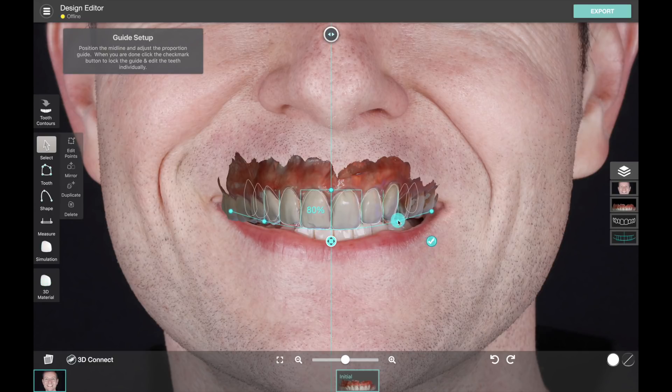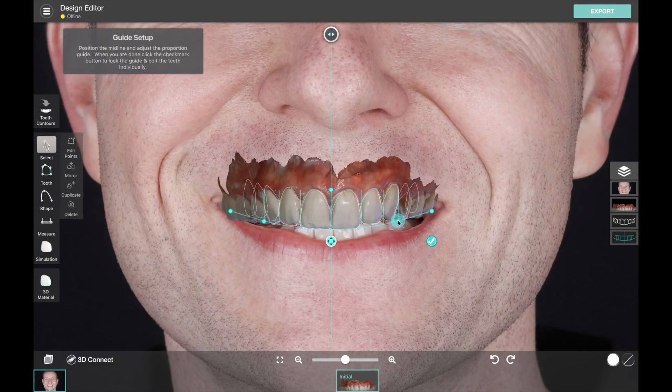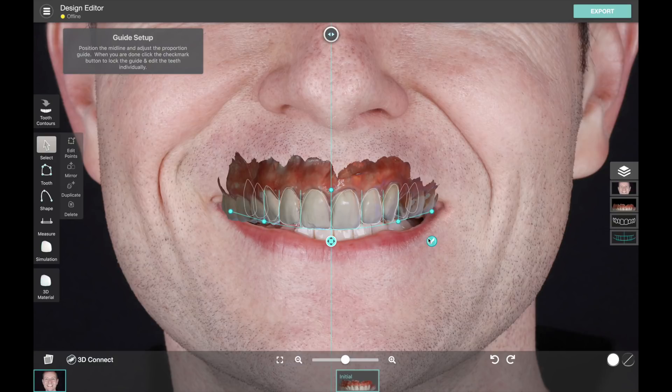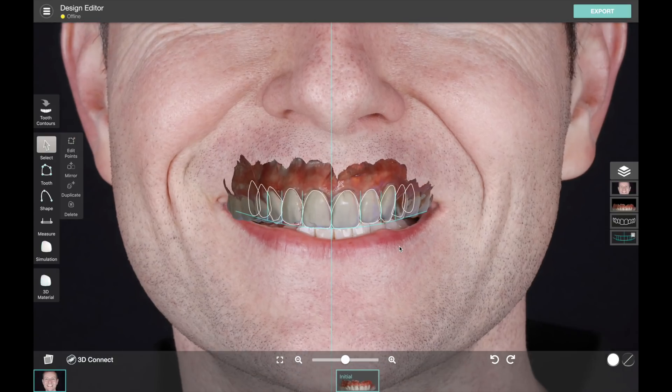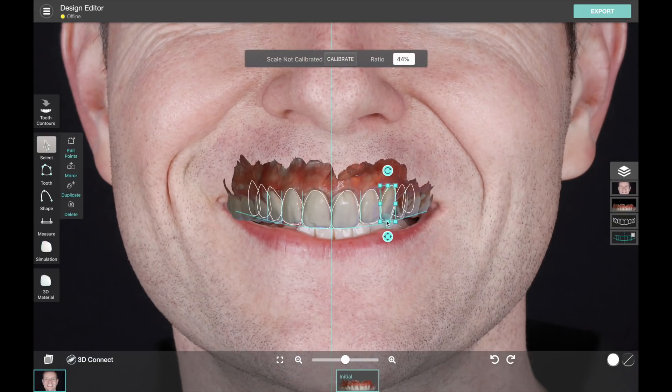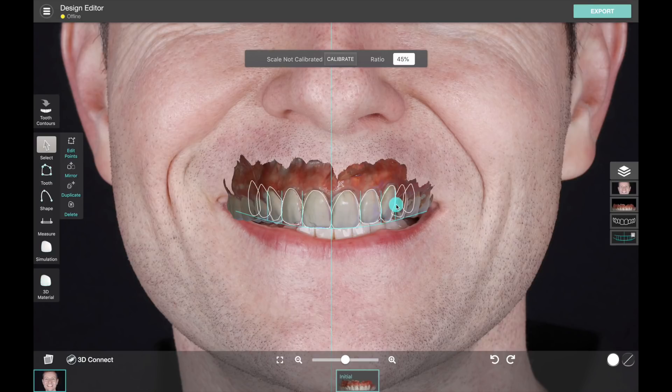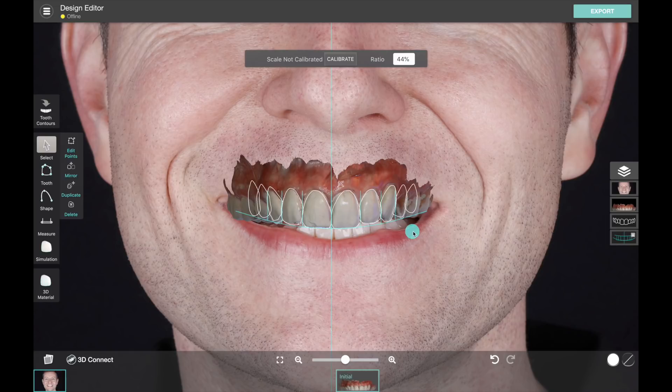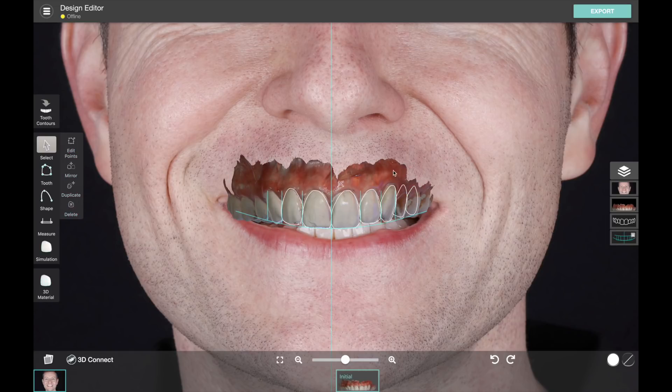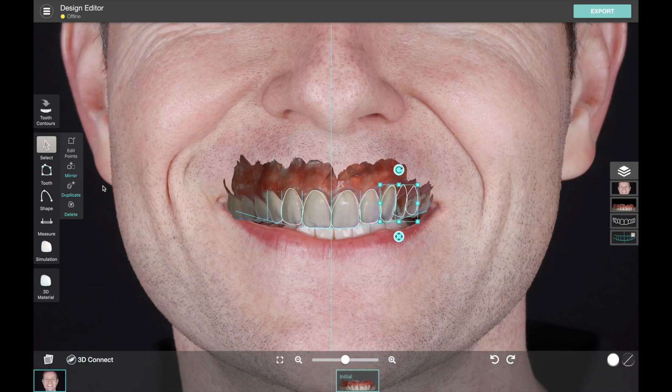So right now we're just going to use this as an intraoral view and we're going to do our basic design. So let's pretend that's going to be our design for this case, and I'm just going to do a quick design here. Okay great.